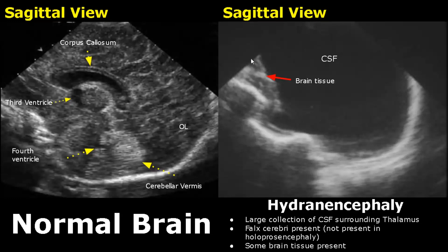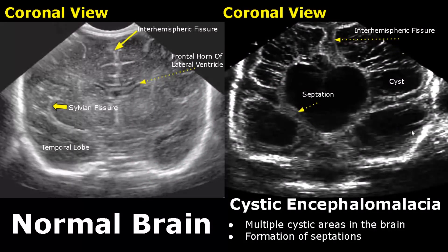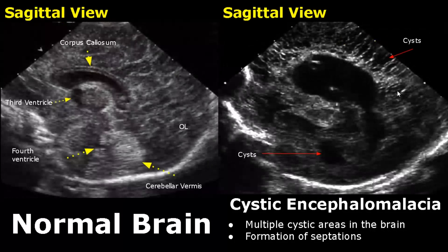Cystic encephalomalacia is a condition in which there are multiple cystic areas in the brain along with formation of septations — multiple cysts and septations are seen. Here is a sagittal view showing cystic encephalomalacia — we see various cysts and septations within the brain.